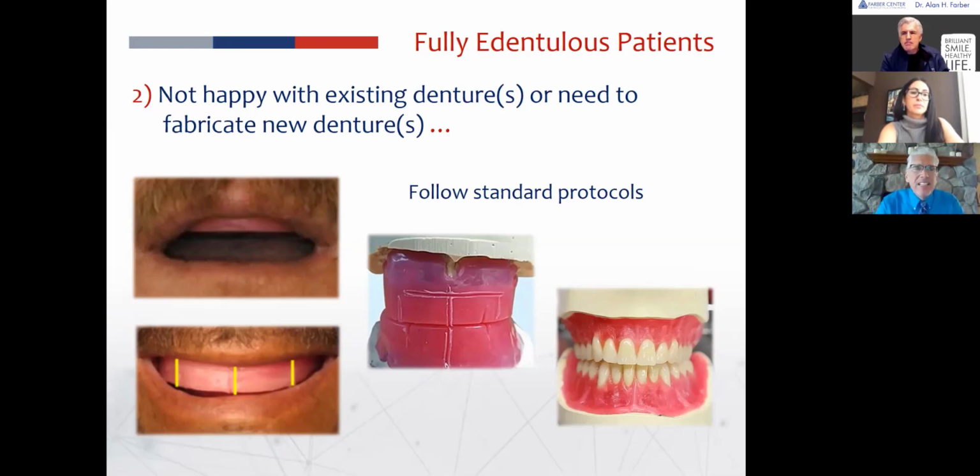The reason for that is we don't want a patient to smile and have their lip get caught up on top of their teeth, either functionally or aesthetically. So knowing the high smile line is also going to help us to know the bone cut, how much bone we're going to reduce. We'll talk more about that as we move along.